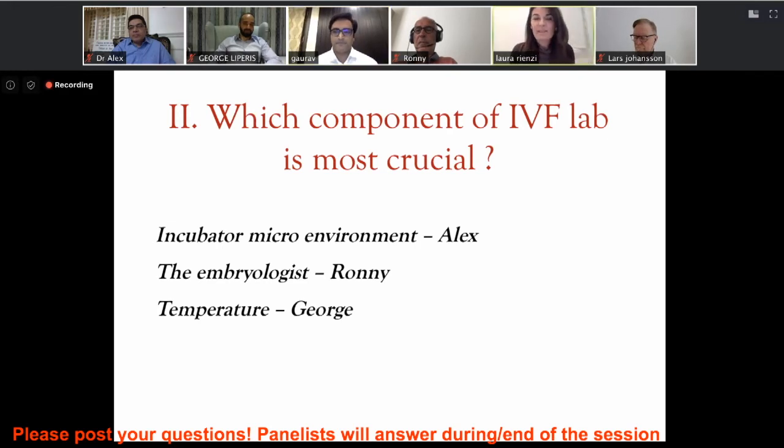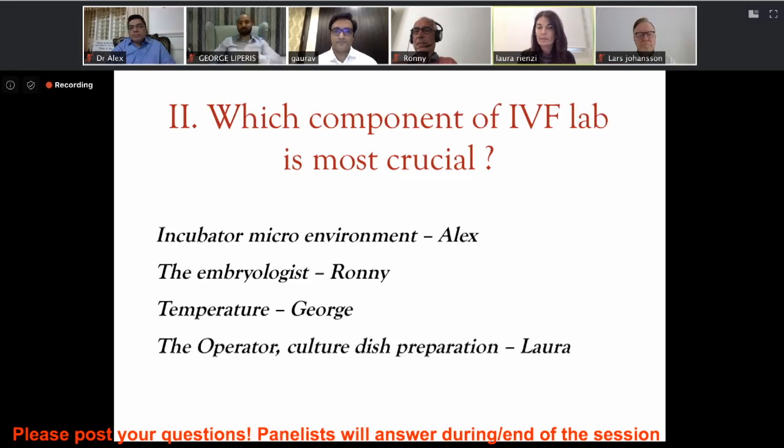I think that it's a little bit a mixture of all the previous answers, because if you are a very good embryologist, but you don't have the technology in your lab, you don't have good incubators, good warming plate, good air conditioning, good environment control, you cannot have good results.